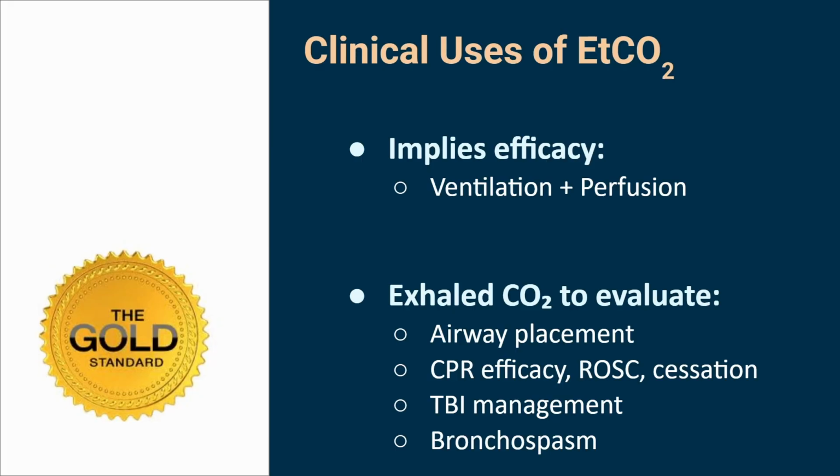I'd always heard that end tidal was the gold standard for intubation, to the point where if you don't get an end tidal reading, then you haven't intubated. Let me encourage you much the same. I was never super good. Well, I shouldn't say never. I guess I got good at it, but I didn't start very good at IVs, unlike Pam. But I started very good at intubation.